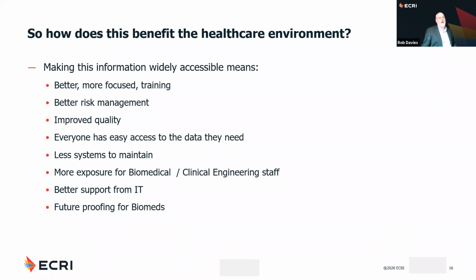With a system like this, it used to be a one department system. If it went down, it never really had much impact on the priority list of an IT department. But all of a sudden, this system is now used by many departments all around the hospital. And if that system goes down, all of these departments are reliant upon it. So they need it, and it's now become a higher priority within IT.